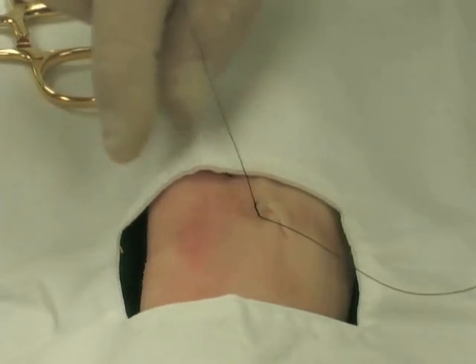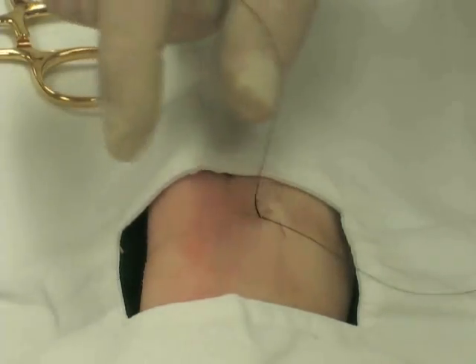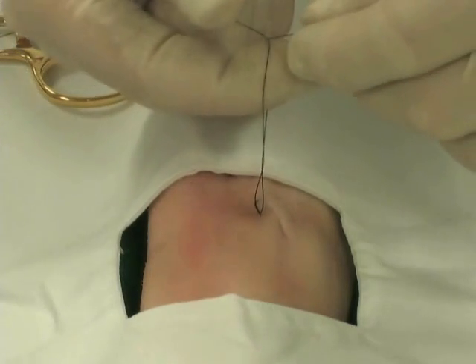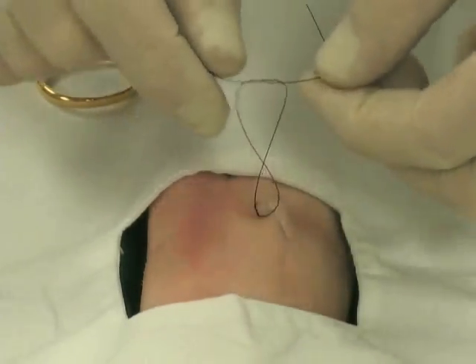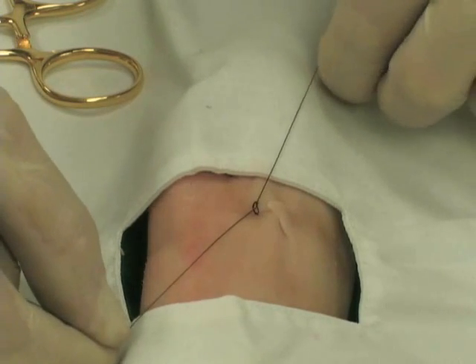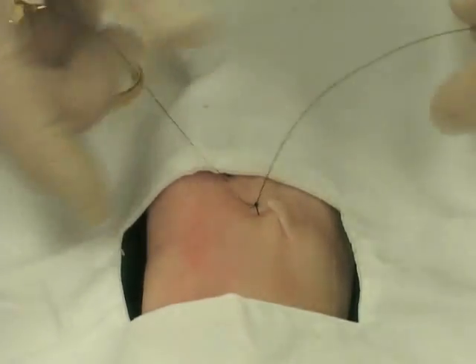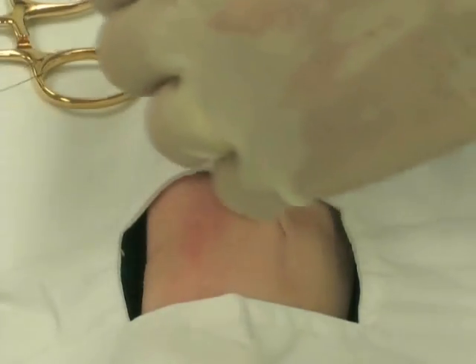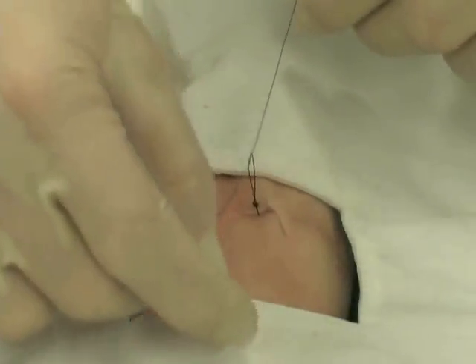For the second suture, with the long end of suture, put your thumb behind it with the short end. Pull it over your thumb, pinch, and push the short end through the hole. This time you'll want to cross your wrist and your hands to get the suture to lie flat. Now that your second knot is tied, it won't slip, and from here on no surgeon's knot is necessary. Then alternate back over your index finger, pulling apart behind your thumb, pinch through, pull through, and cross. Four to six throws is adequate.